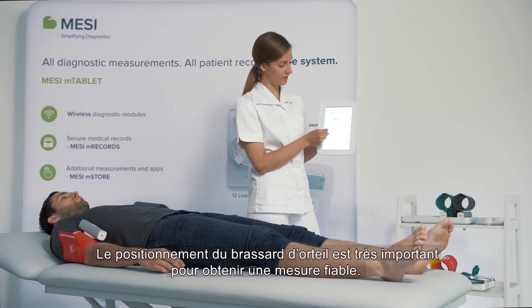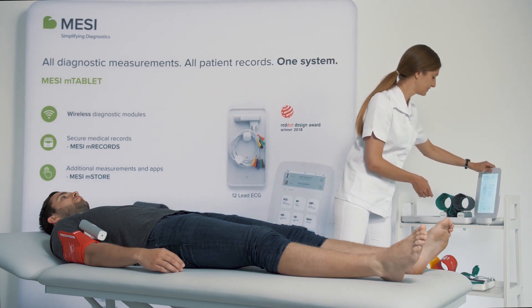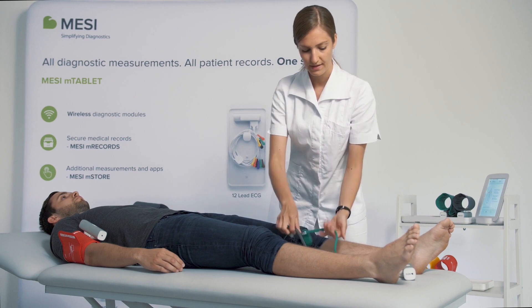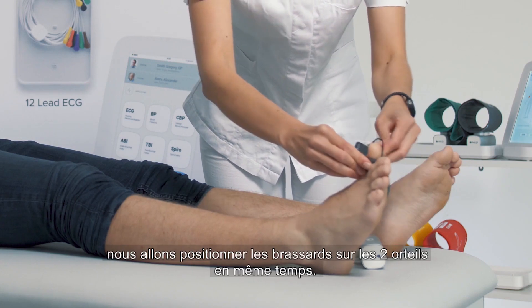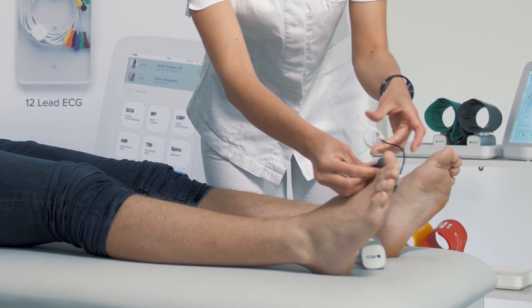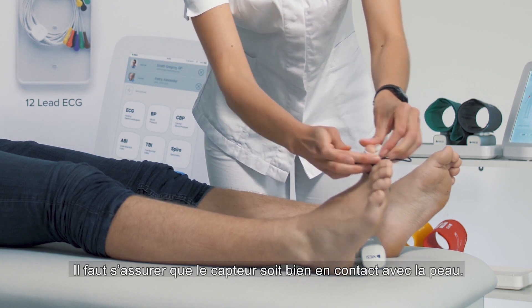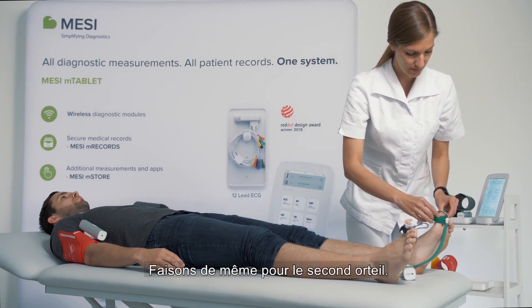The toe cuff placement is very important to get accurate results. We take the module with the toe cuffs, and because the measurement is done completely simultaneously, we put the cuffs on both toes at the same time. You should make sure that the probe makes very tight contact with the skin, and we do the same on the other toe.